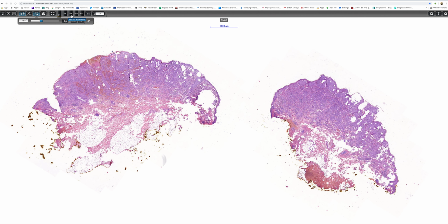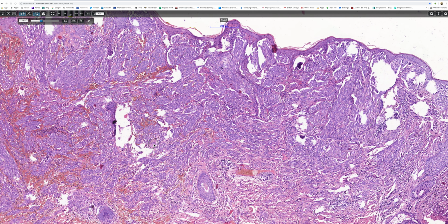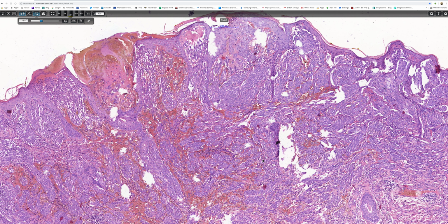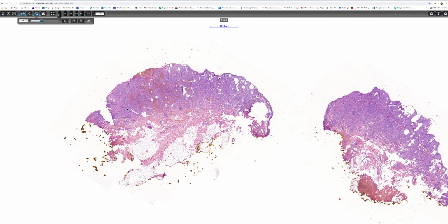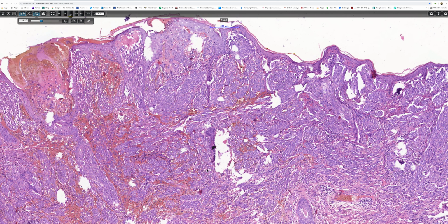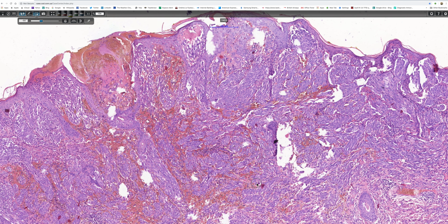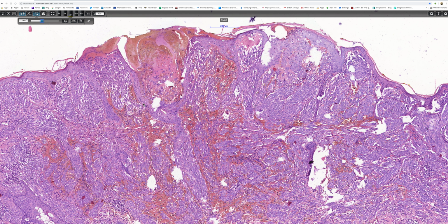Now, I wanted to make another point to you about maturation, because maturation is two things. Sorry, I'll go back to low power again. Not maturation, symmetry. Symmetry means that the left side matches the right side, and it's quite hard to tell on this lesion because we're missing so much of it. But what we can do, and it's quite useful, is look at the top, and then we can compare left and right. Let me just straighten that slightly. There, that's better. So there's the top.